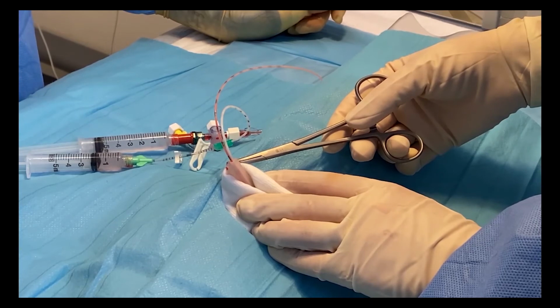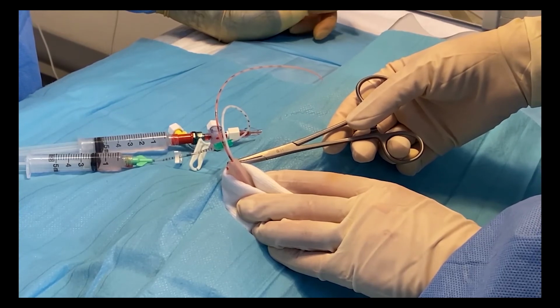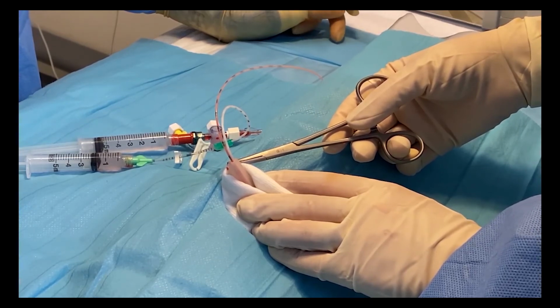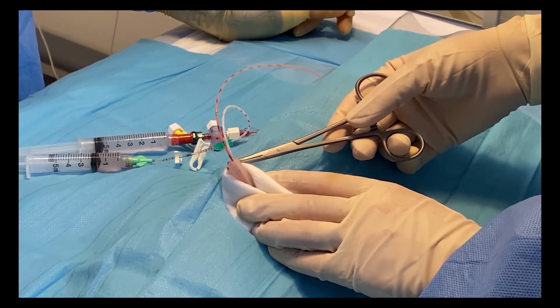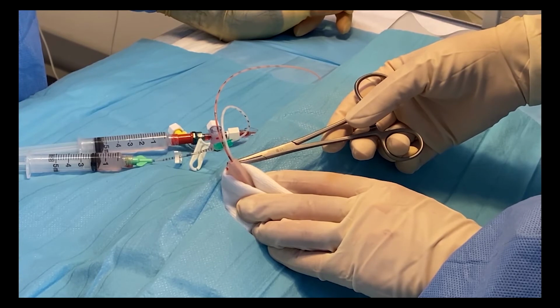Once you're happy with the position of your umbilical lines, you may wish to take a sample of blood. It's very important to take a good discard before then aspirating the blood for the sample itself. After that, you'll need to make sure it's flushed through with saline before moving on to securing the catheters with sutures, which I'm going to demonstrate now.